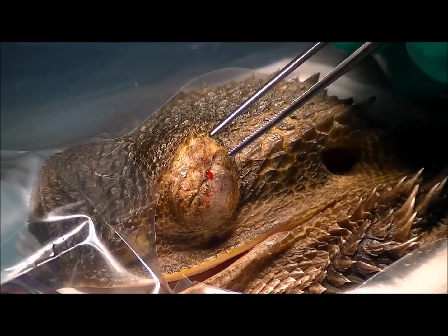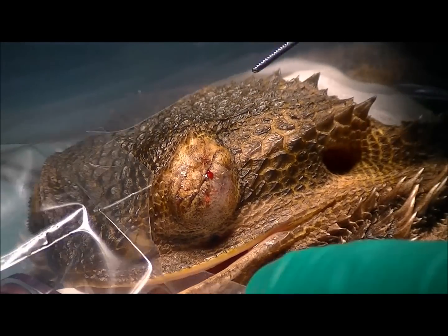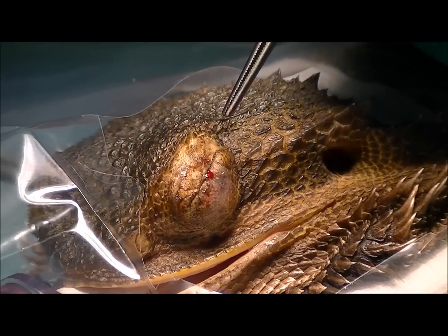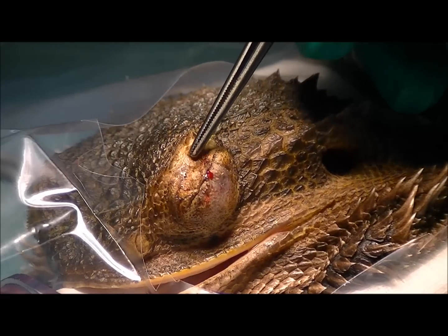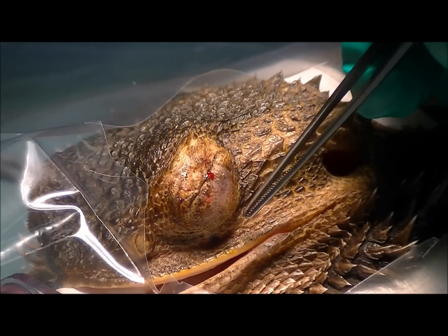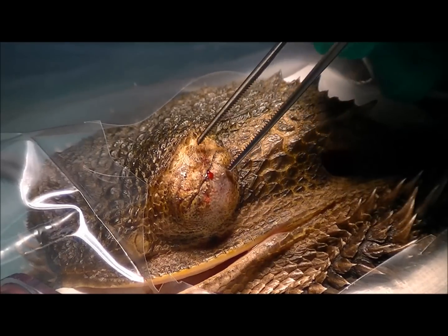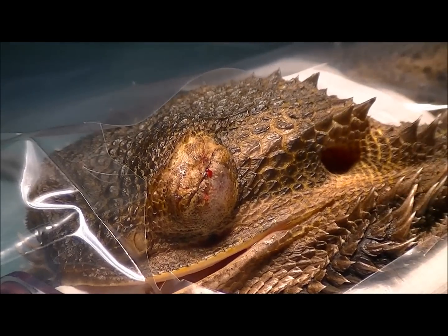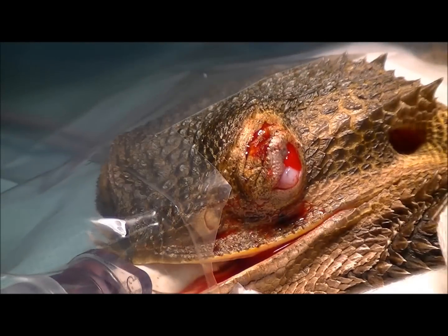We've stitched these eyelids shut now, but obviously that just hides the problem underneath, so we're going to need to take this eye out. My plan is to make an incision around where I've stitched it and work my way around behind the eye to remove it. So I've started to make our incision around the eye.